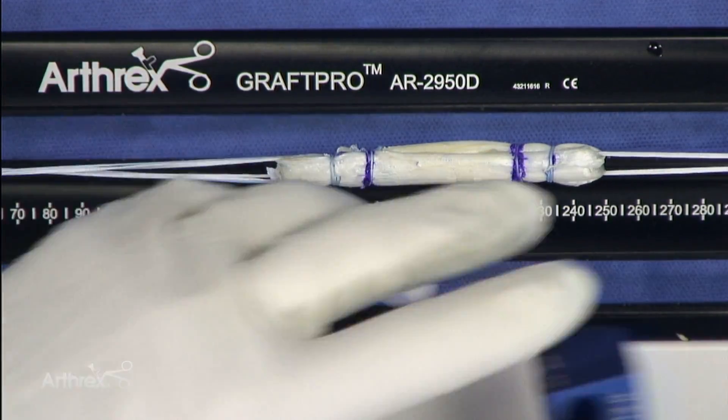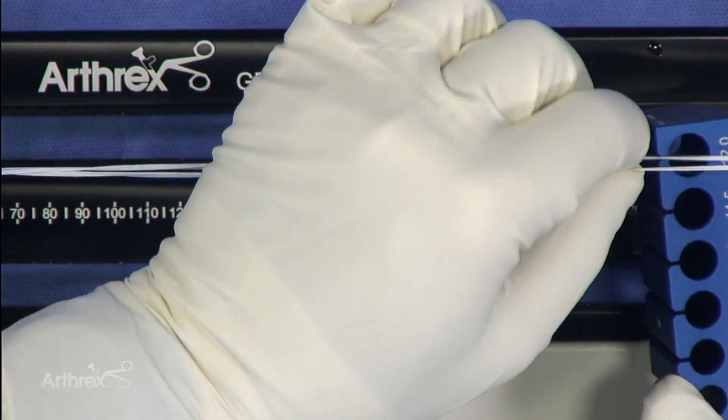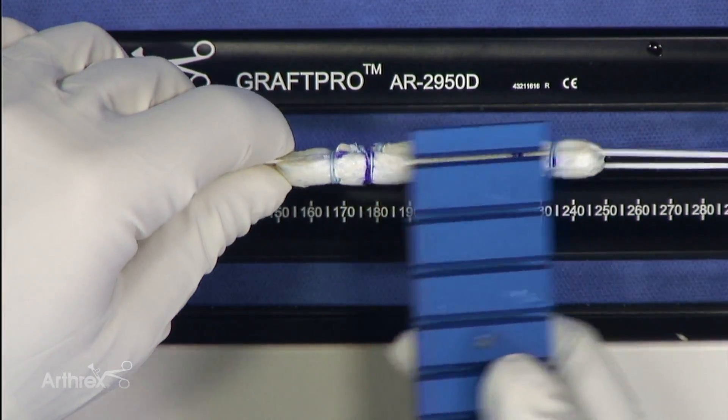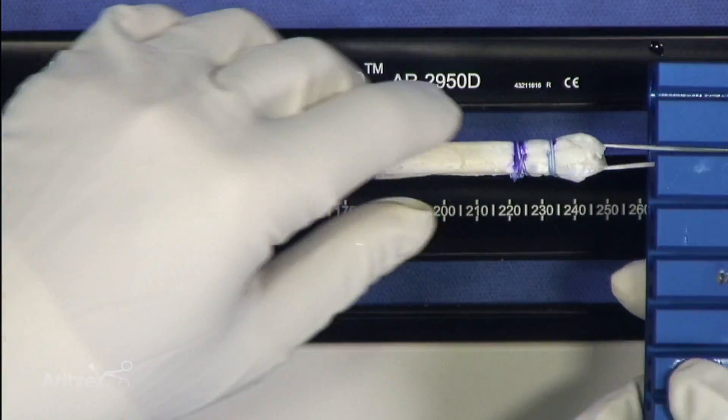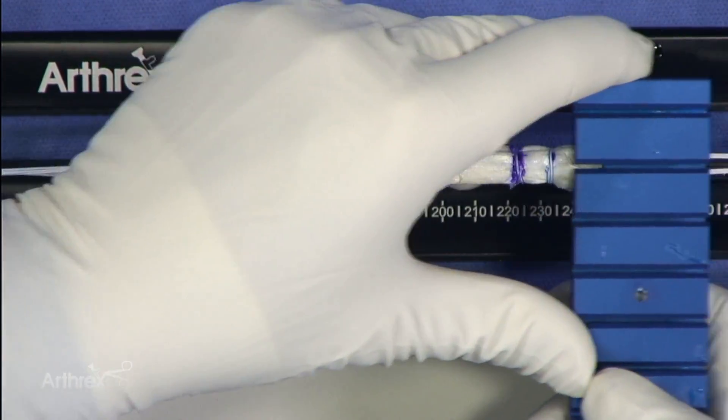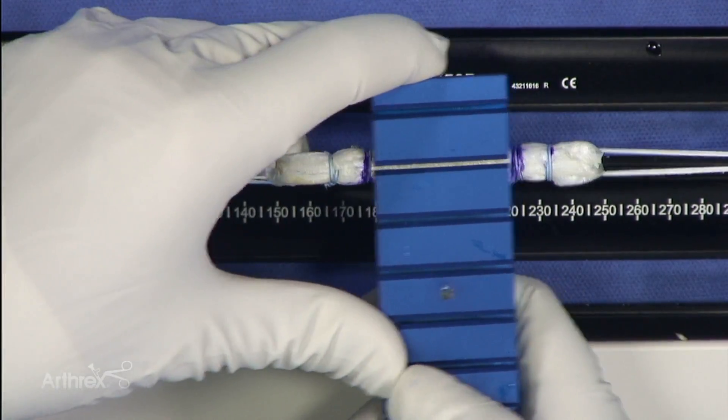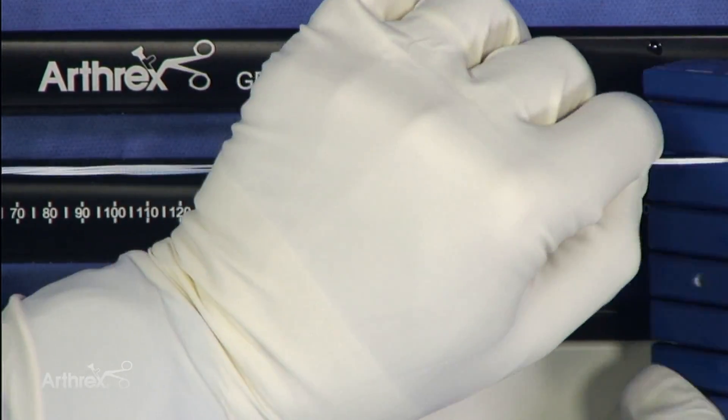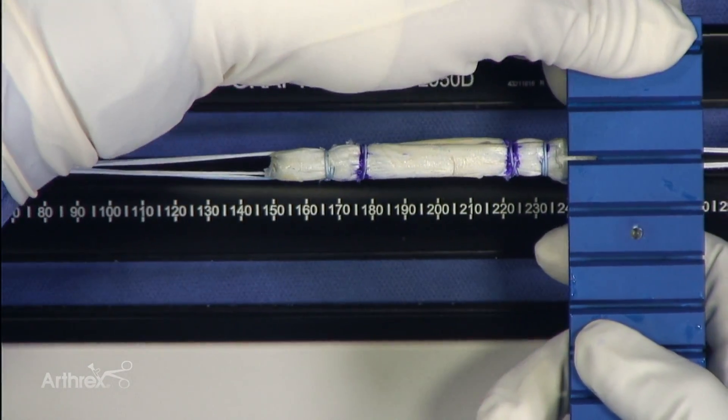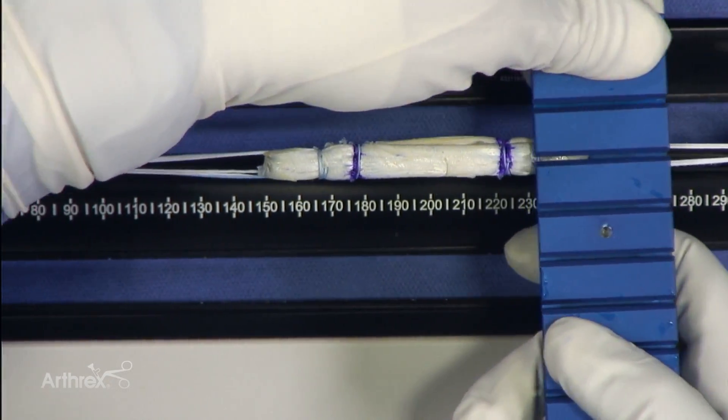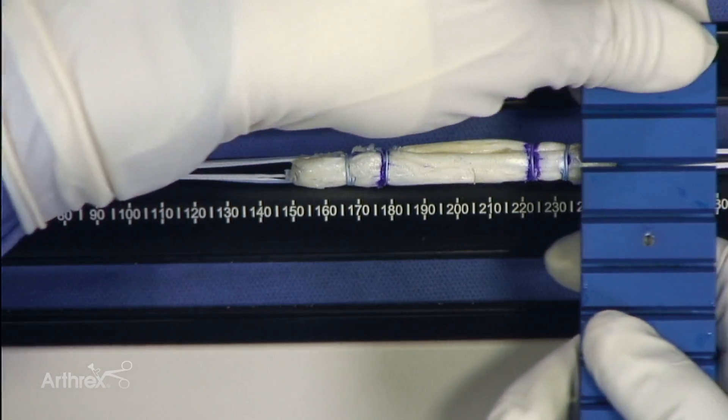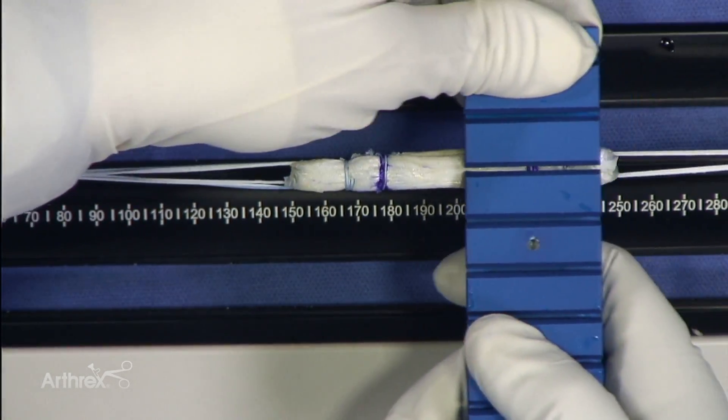And now we're going to do sizing again. So here's the 12, and it's just slightly loose at the 12. Here's 11 and a half. Now that's getting a little snug. And I'd say that 11 and a half on the femur. Here's the 11. Now the 11 starts getting pretty tight. See it's moving the board. But I could get it. And you could do this all day.